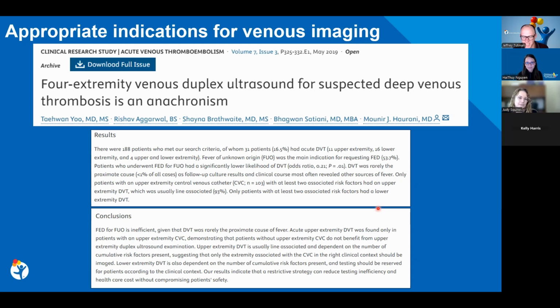That's crazy sometimes. Yeah. Kelly, would you mind talking from the sonographer's point of view about how challenging these are to accommodate from a workflow perspective? Yeah, of course. I agree completely. It takes a lot of time, and often these are ordered on really critical patients with very vague indications.